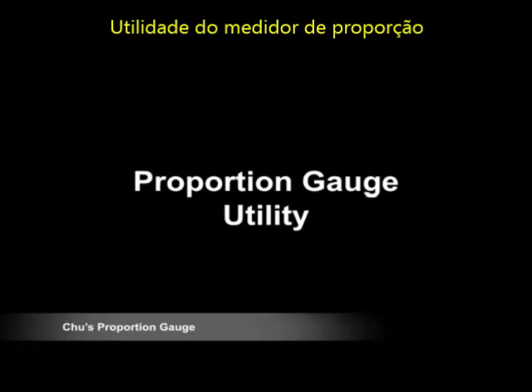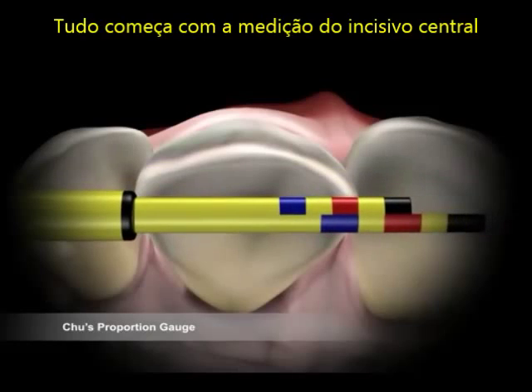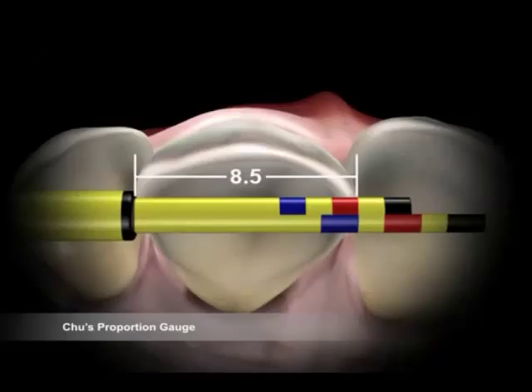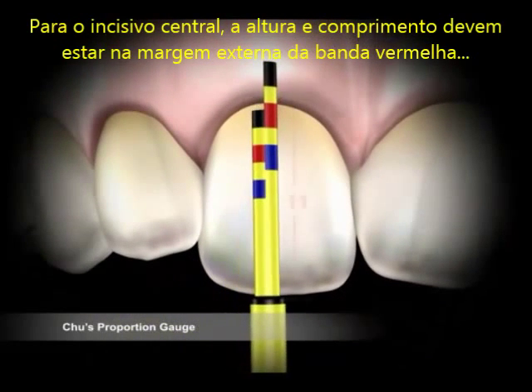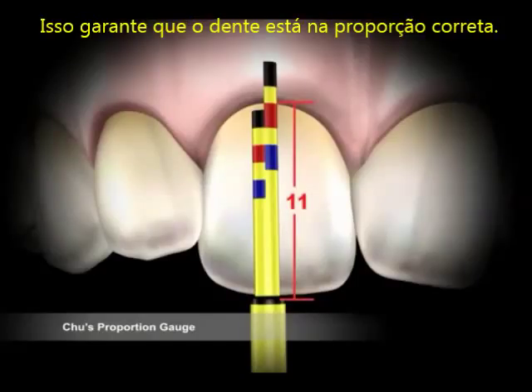Proportion gauge utility. Always start with the central incisor measurement first. Once the incisal edge position is determined, rest the incisal guide on the tip of the incisal edge of the tooth to be measured. For the central incisor, the length and width should be at the outer margin of the red band on the vertical and horizontal arms, respectively. This ensures that the tooth is in the correct proportion.